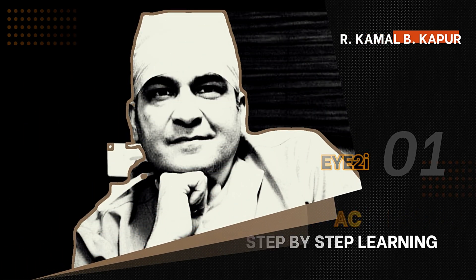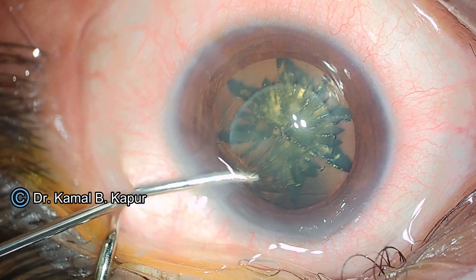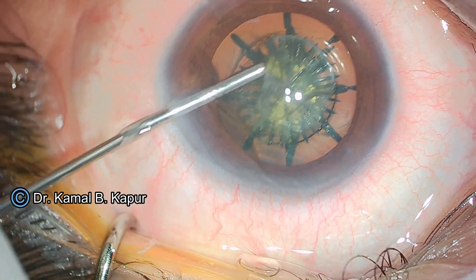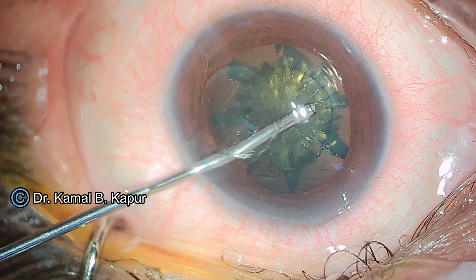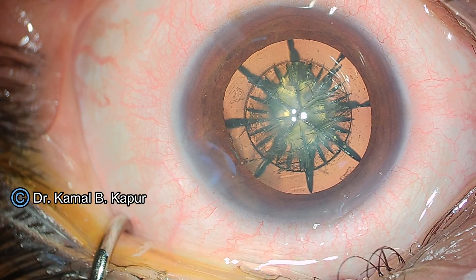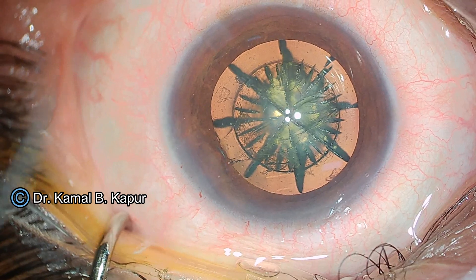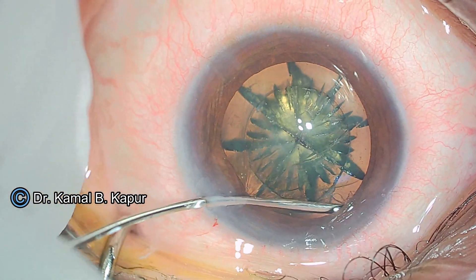This is a video demonstrating the use of the injector cartridge of the Relux Smart lens in a case of femto cataract surgery. We see a free-floating capsulotomy made by our machine. The capsulotomy is simply pushed out of the anterior chamber using viscoelastic. We then proceed to do a hydrodissection.